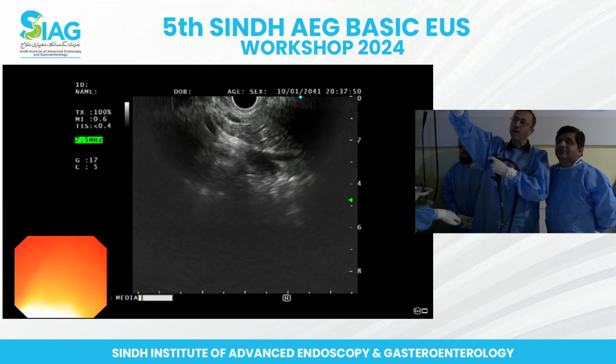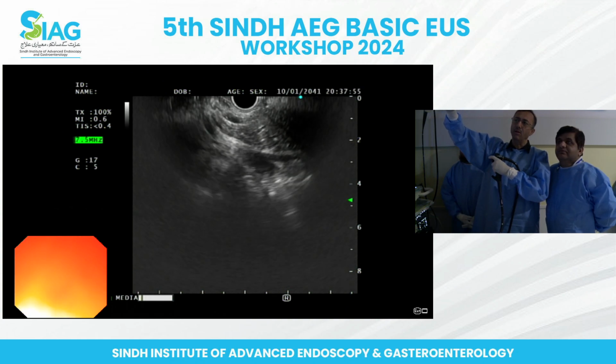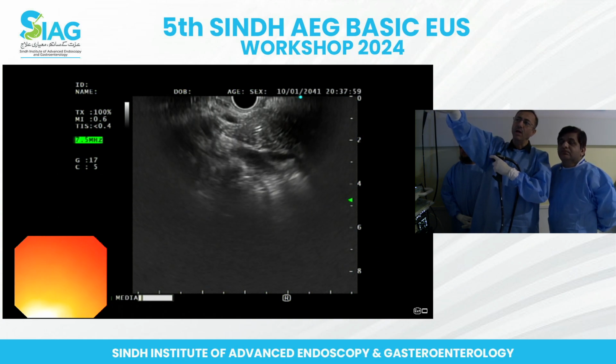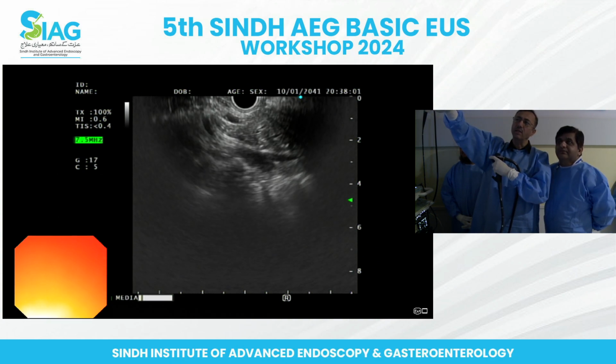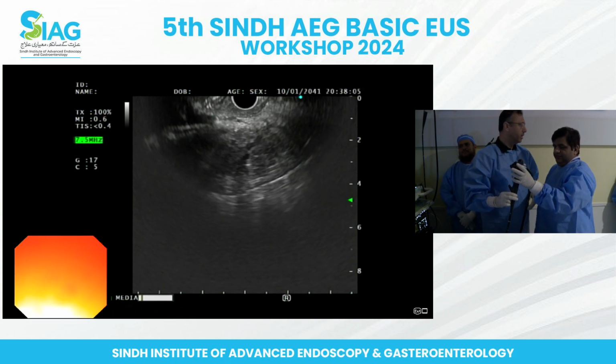And just 1 to 2 millimeter below that, towards the spleno-mesenteric vein, you have some hypoechoic linear structure, which is most likely the pancreatic duct. Okay? Now, try doing it again.